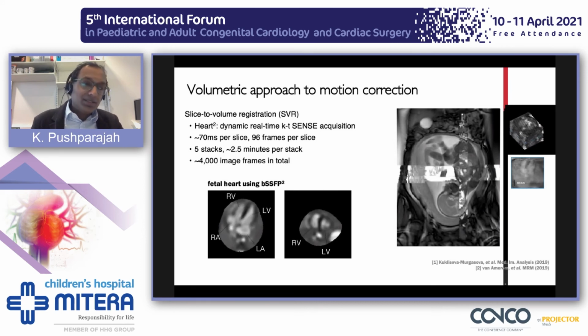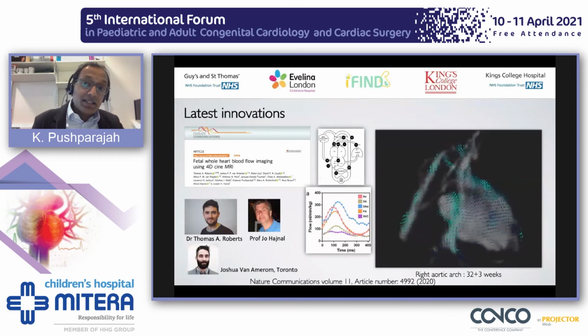It requires quite a lot of computational time at the moment. So it's actually not really point of care treatment at all. It takes several hours, but all of that can be accelerated. So within that 3D cine data, we're also starting to extract flow data. So now it gets really exciting. You've got 4D flow data within a fetal heart. Now that opens up all sorts of doors.